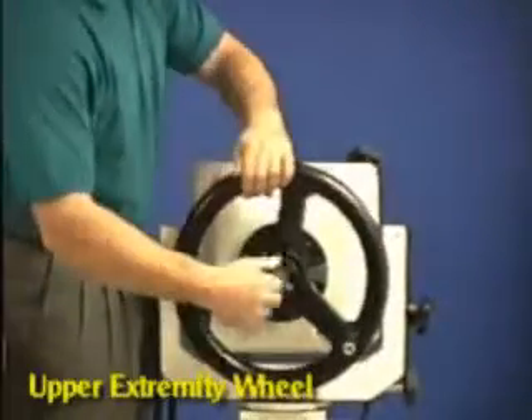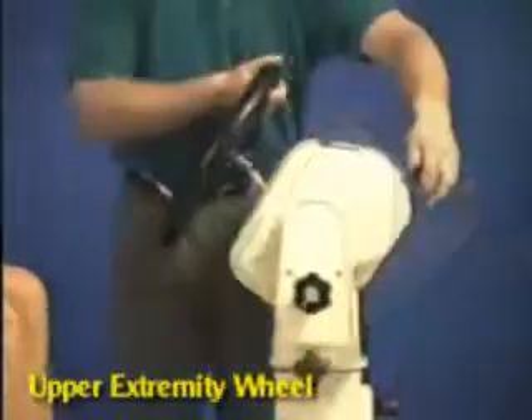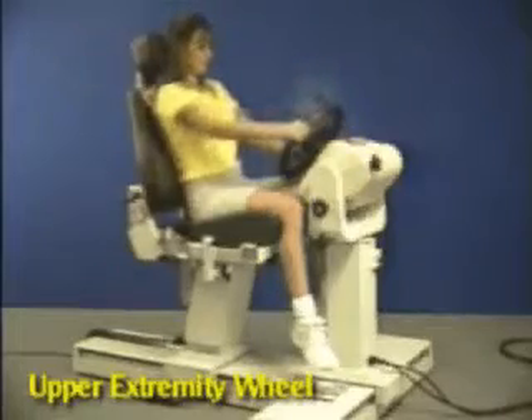Attach the upper extremity wheel to the dynamometer. Rotate toward the patient and tilt up. Move the patient in and set range of motion stops.